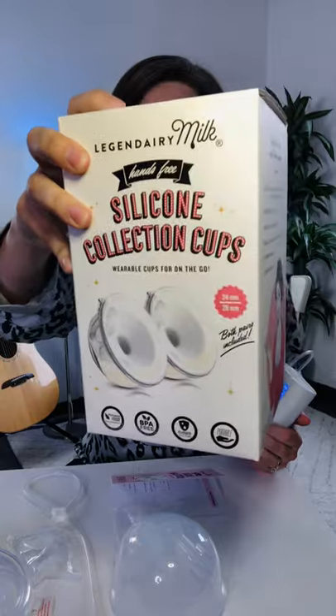Hey everybody, I finally got my Legendary Milk cups in the mail, so today I'm going to unbox them. I actually have one pumping right now for you, so let's take a look.